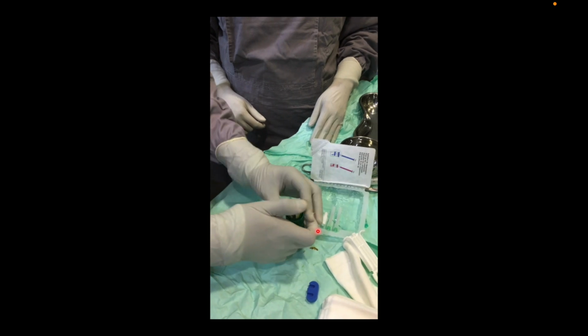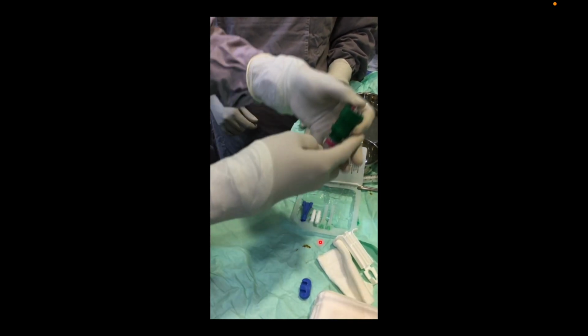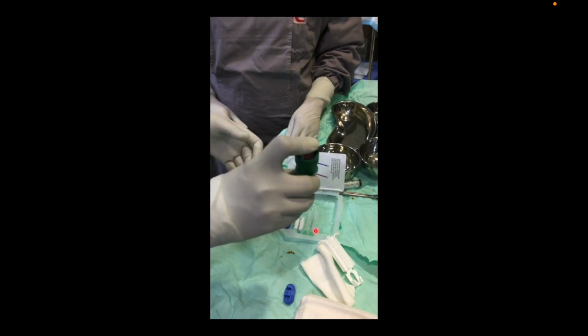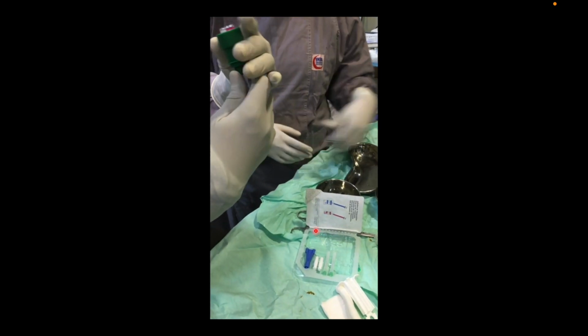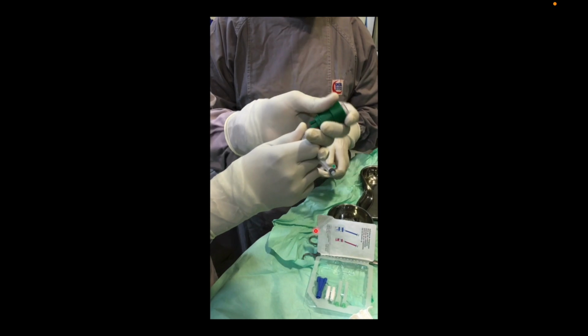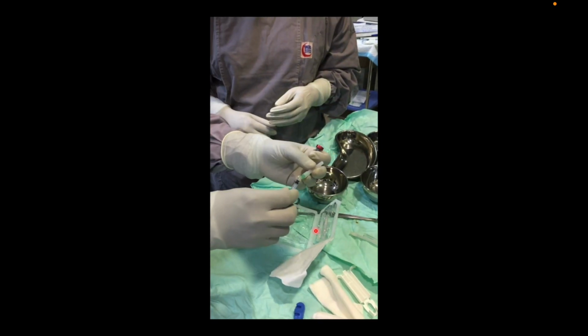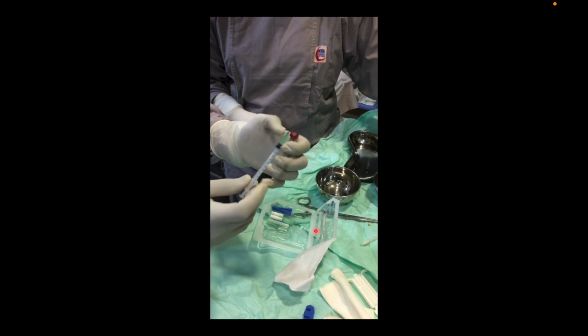So one bottle has saline in it, the other bottle has powder in it, and once you press them hard like this, then the saline enters into the powder. So Dr. Irfan Lutfi only uses thrombin, he does not use fibrin. So here you can see the two bottles are connected to each other, the saline bottle and the thrombin powder, and once they get mixed up, there are two syringes provided in the pack.